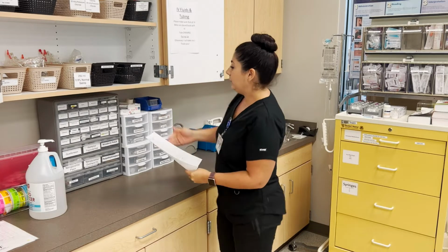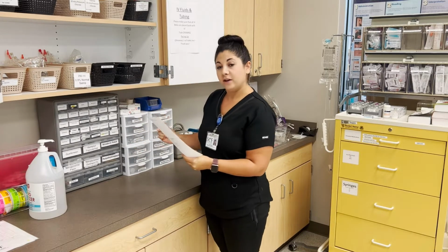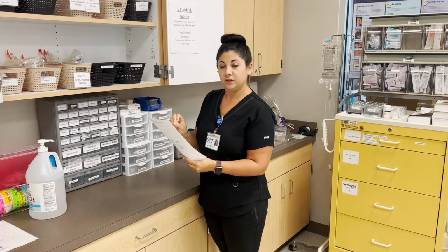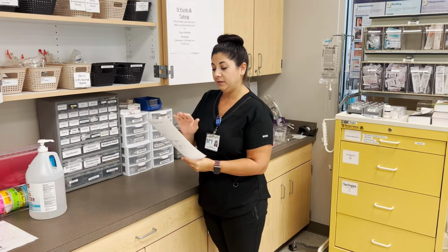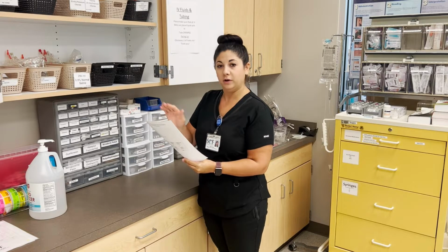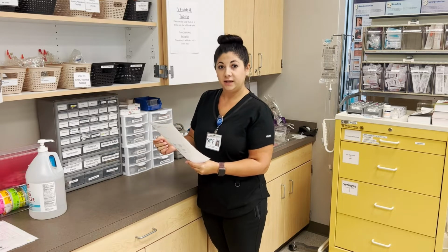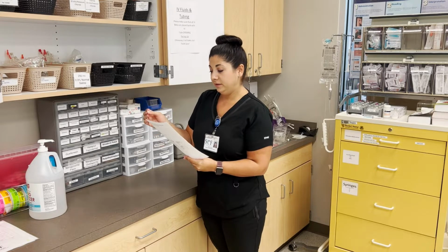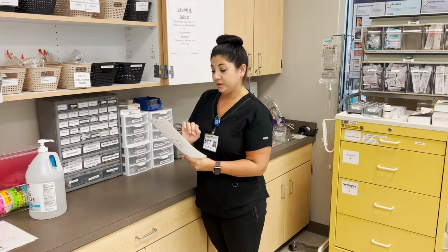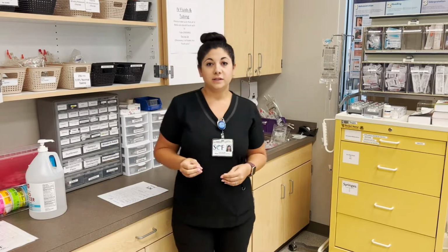Then I will pull the medications from our automated dispenser. Once I have what I need for each medication individually, I'm going to compare it against my MAR. So I'm looking at the name of the medication on the MAR and the med. I'm looking at the dose. I'm checking the expiration date to make sure they are not expired. And I am making sure that the route is correct. Once I have pulled all of my medications, I will grab any supplies that I need.